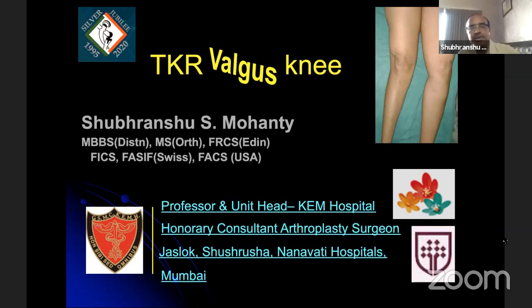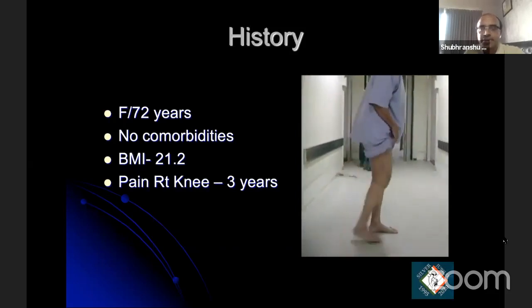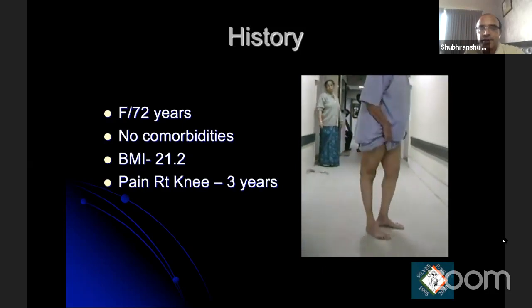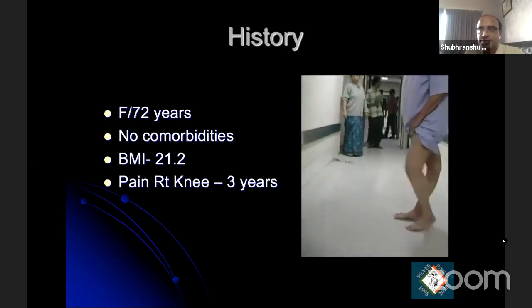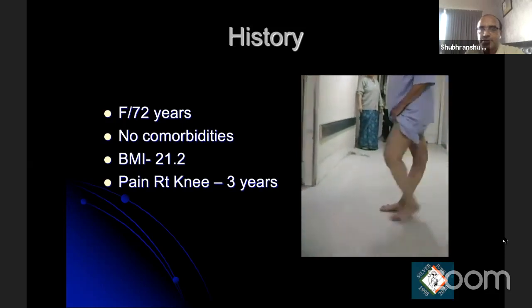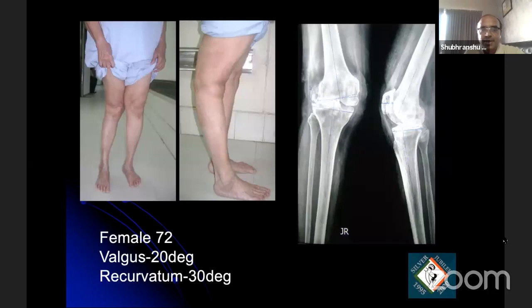Yeah, good evening, friends. I'm going to start with a very simple case, and I'm going to focus on the planning and the patho-anatomy in the case of a valgus knee. Here is my case. It's a 72-year-old female, she doesn't have any comorbidities, she has a normal BMI, and she has had pain in the right knee for the last 3 years. And this is how she was walking. As you can see in the video, the knee slowly goes into hyperextension, and there is associated valgus as well. In the X-rays there is a valgus of about 20 degrees and a recurvatum deformity of about 30 degrees. So how are you going to proceed when this case comes to your clinic?